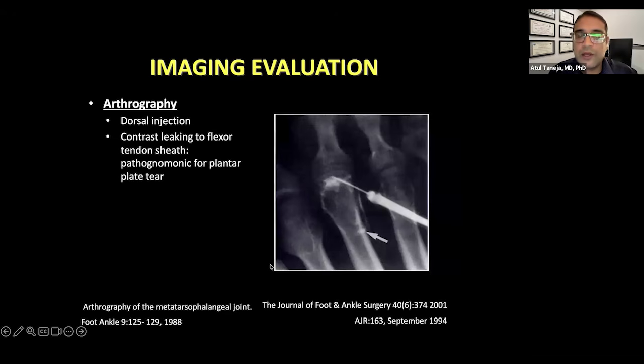All right, let's move to the approach to possible plantar plate tear if there is this suspicion. Old school type of exams like classic conventional arthrography, we don't do that anymore.